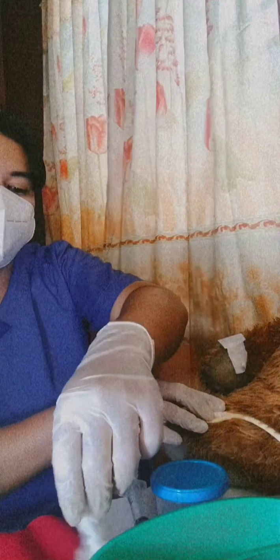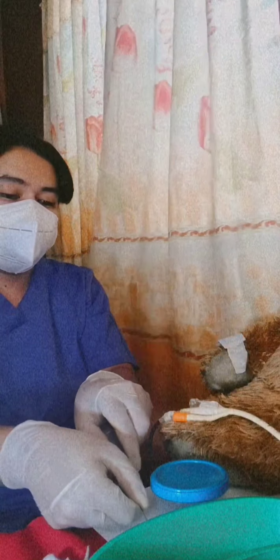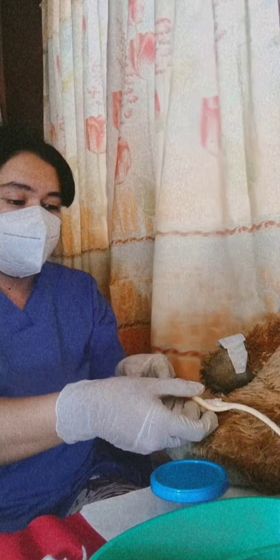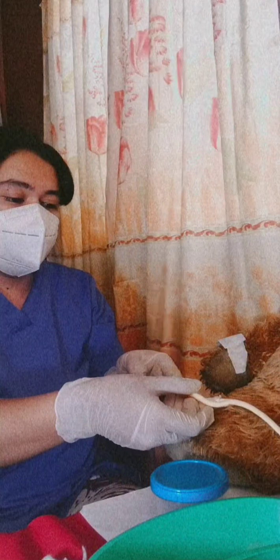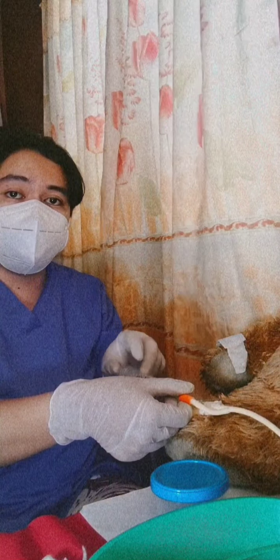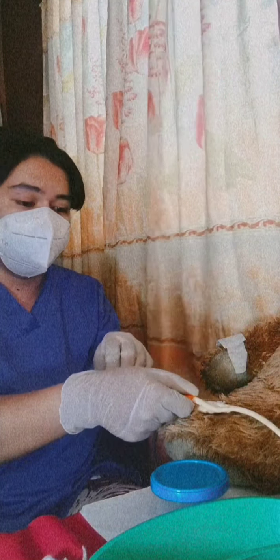And then using the hub of the syringe, insert it into the port of the catheter, and then aspirate all the fluid that was used to inflate the balloon inside.